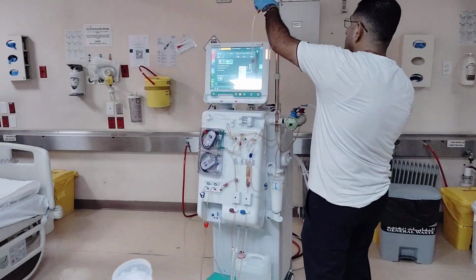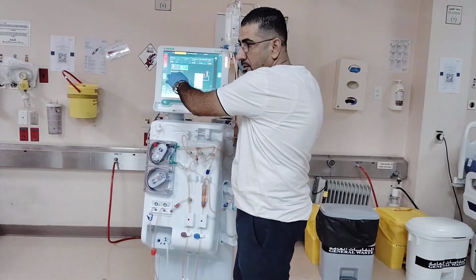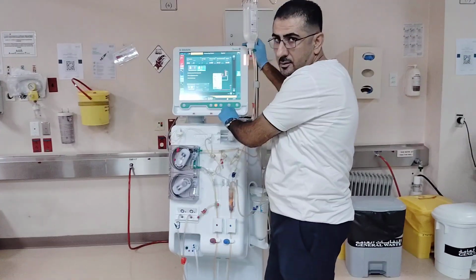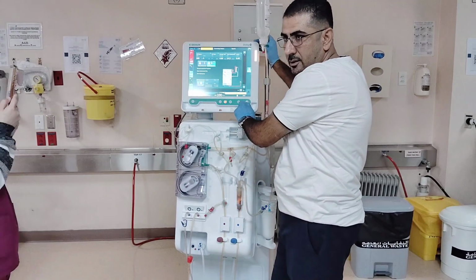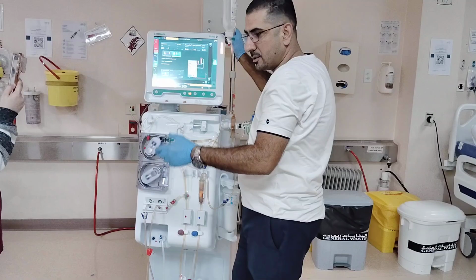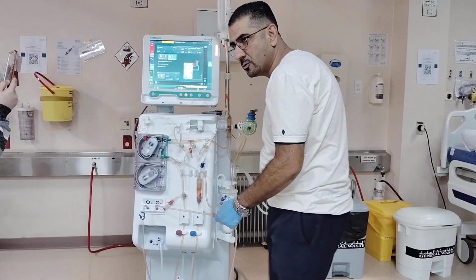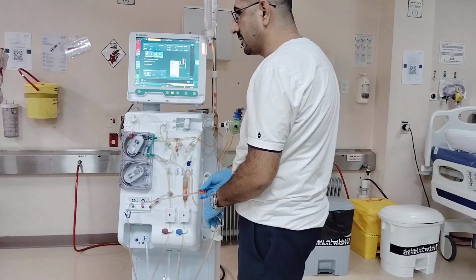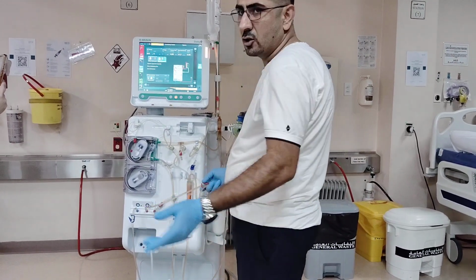Now, we are still in the connection phase. Here again you will get two icons, for the white connection and the red connection. Red connection means you will start to connect the arterial line only, and keep the venous connected here just to remove the fluids, in case you have hypertension, the regular one.